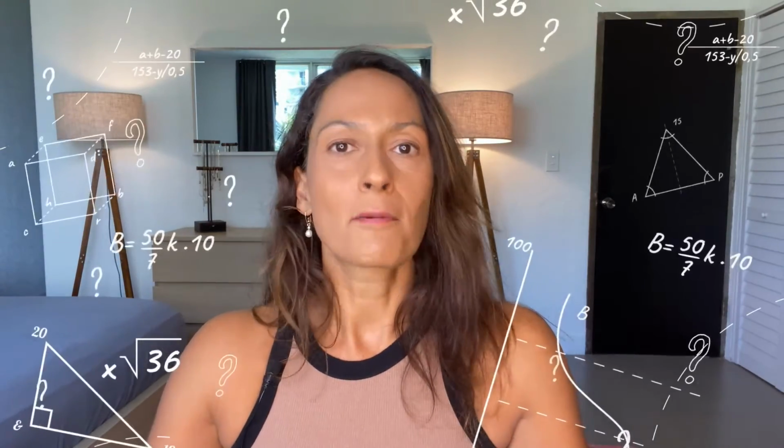Had my blood sugar been lower than my target, for example, had it been 80 or 90 milligrams per deciliter, I would have ended up with a lower dose. However, had I eaten, I would have to add the dose for the food on top of this calculation. This is a lot of math. So let me just show you a way that I do it with somewhat less math.